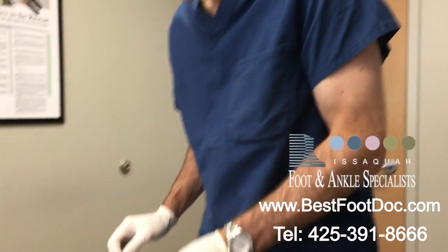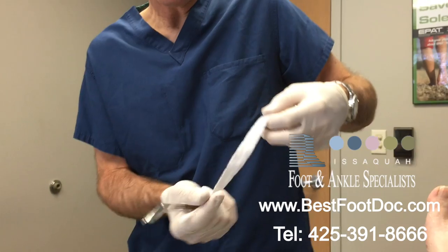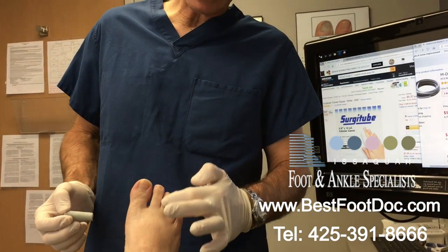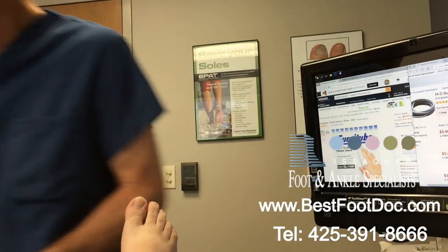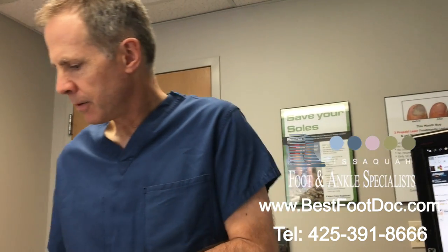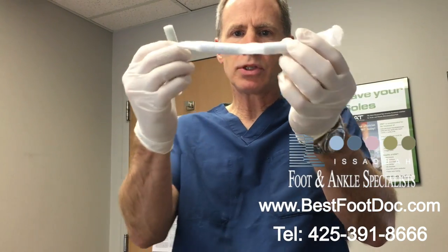Here's what you do. You take some of this surgical tubing and cut it off. Then you take some of this backer rod and cut it to the width of, let's say, three toes. You get that for all three toes, but you need two of them — one for the top and one for the bottom. You've got the three toes, and you take this surgical tubing and tuck the backer rod into it. I've done that with two of them.